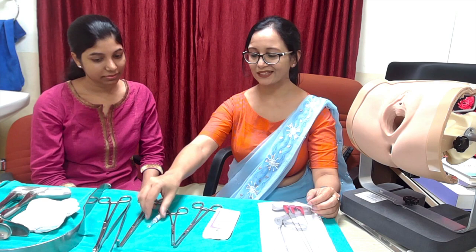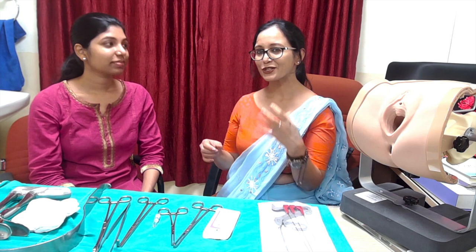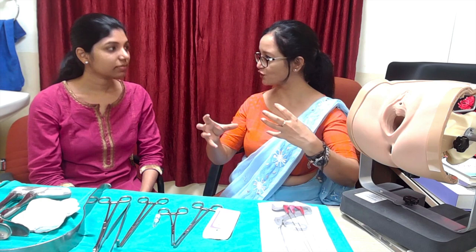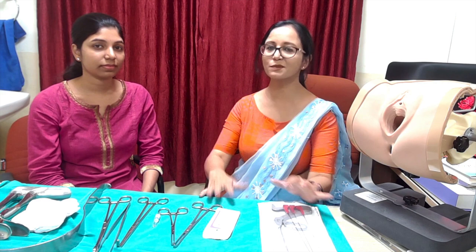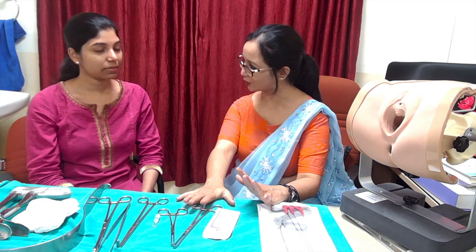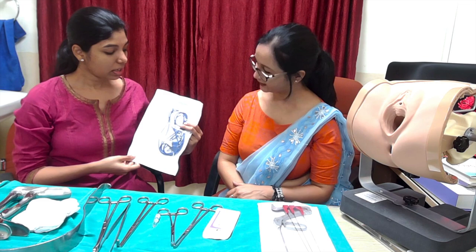If you inject too much solution — 50 or 60 ml — rectal retraction becomes very difficult because you are creating a fluid bubble in an already limited space, which hinders retraction. Around 20 to 30 ml of hydrodissection solution is more than enough. Don't be over-enthusiastic about preventing bleeding with adrenaline only to find you have no space to work in.